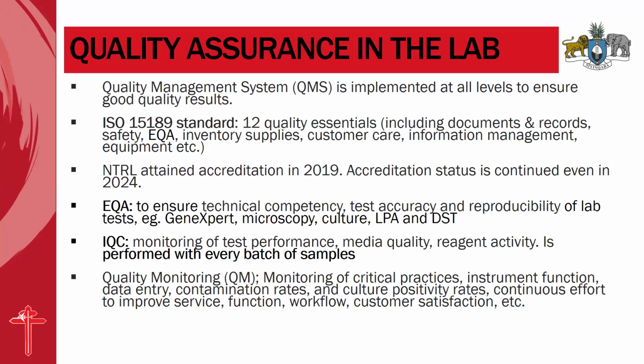The quality monitoring also includes the monitoring of critical practices of the lab. It can be adherence to SOPs, instrument function, data entry, contamination rates. It can be quality indicators as well, such as culture positivity rate, continuous effort to improve service, function, workflow, customer satisfaction. So there are these continuous quality monitoring programs in the lab to ensure that quality is ensured in the lab.